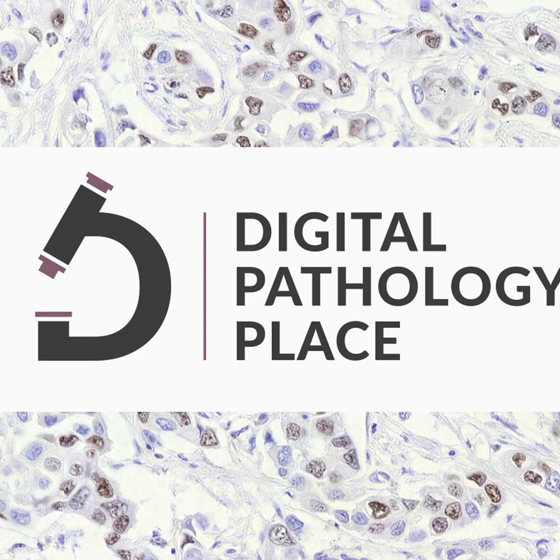So hyperparameters are things like the size of your model, how wide the layers are, how deep they are, what size individual filters are in it. So like a receptive field, what size of window to look at as it's capturing different patterns in your image. It's also things like what optimizer, how much image augmentation, so how much random transformations to apply to your image, which transformations to apply. All those can be regarded as hyperparameters that you can take a guess at. And if you're experienced, you might guess in the right ballpark, but generally you need to tweak them at least somewhat to get to an optimal model.